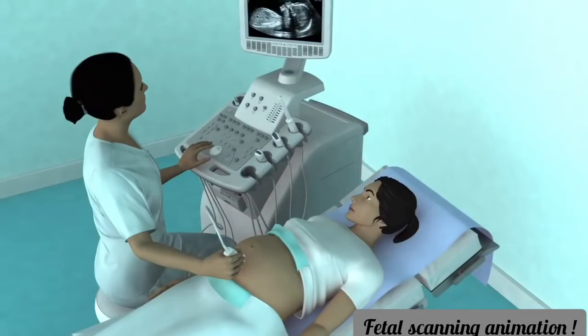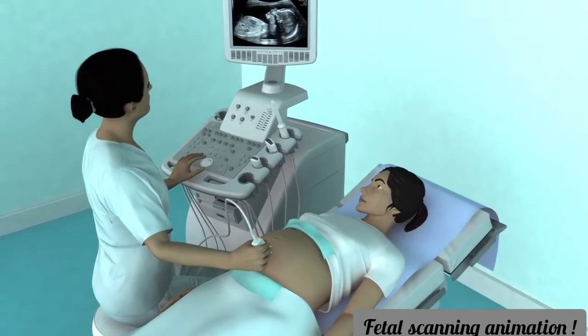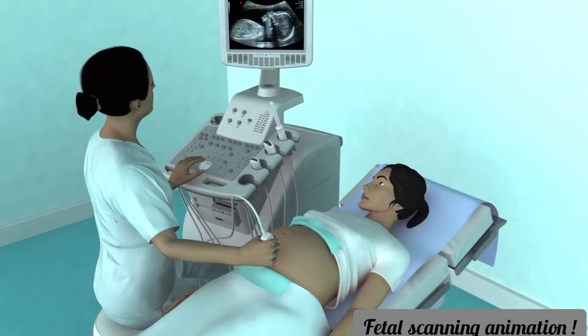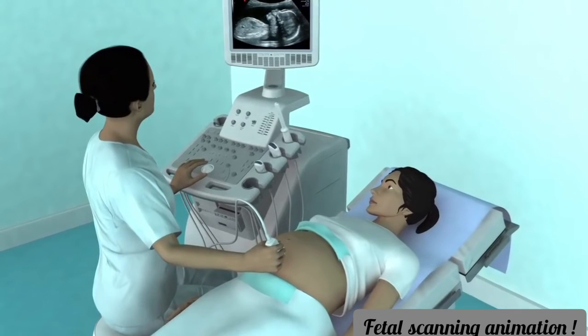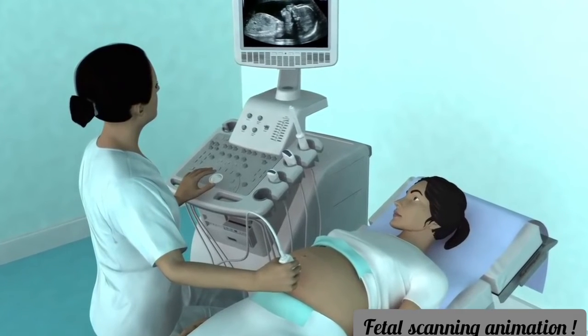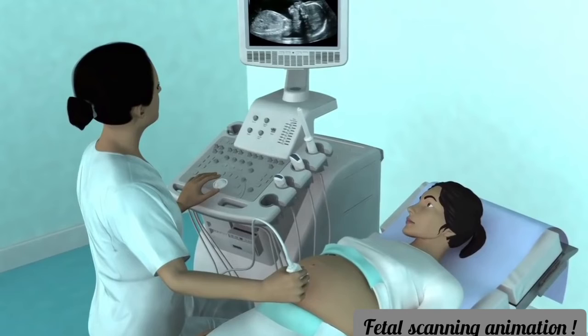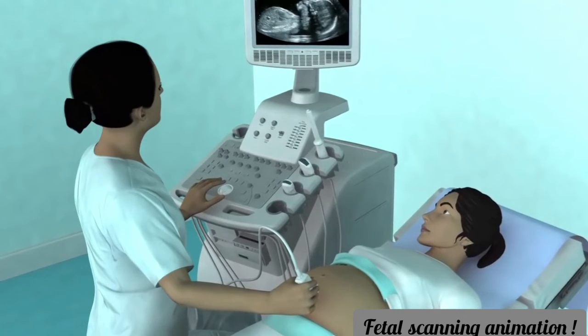To take the biometric measurements, apply the first sweep and planes 4, 5, 7 and 11 of ISUOG's standardized 20 planes and 2 sweeps approach. It is good practice to take each measurement at least 3 times to make sure your technique is consistent. Store each measured image on the machine.